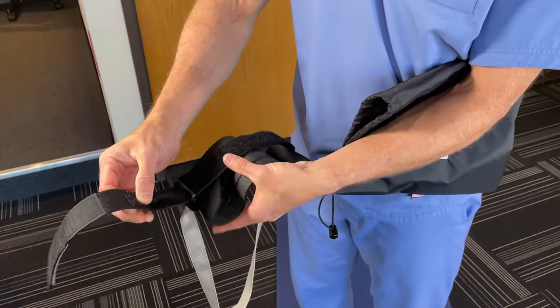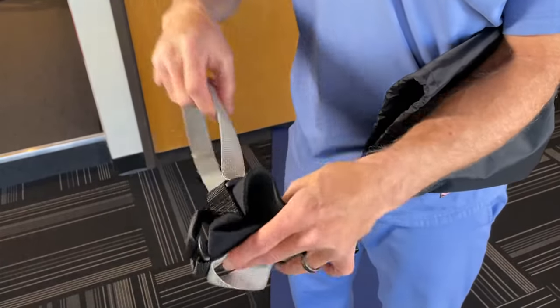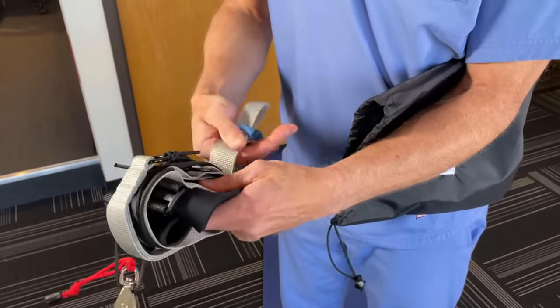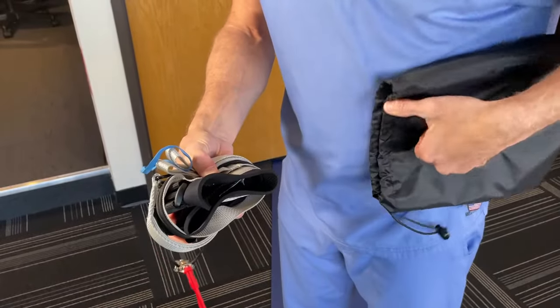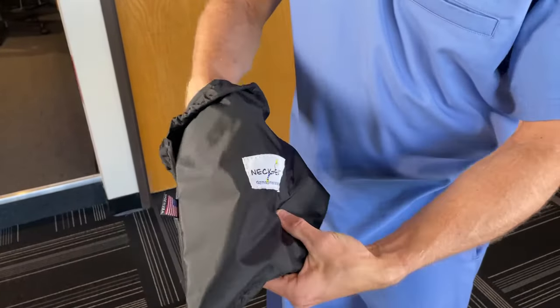Prolong the life of your NeckEase by lining up the hook and loop velcro on the head strap so it doesn't fray the other components. Roll up as shown and keep it stored in the included stuff sack until it's time for another pain-relieving session of neck decompression.